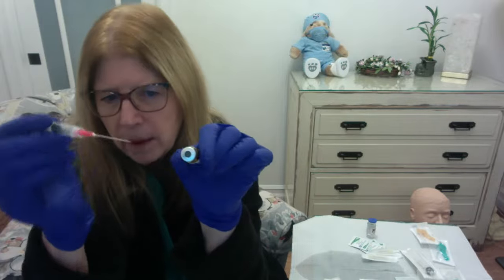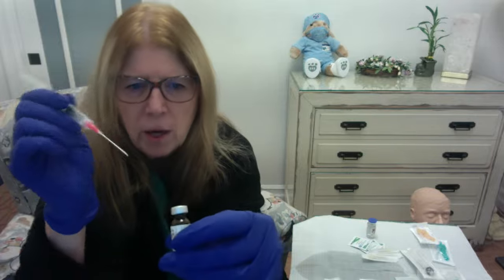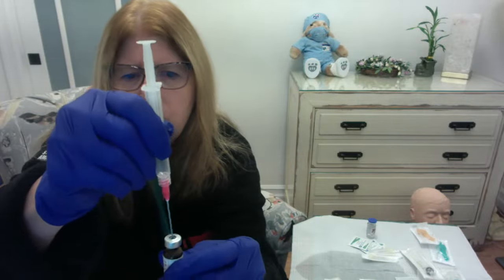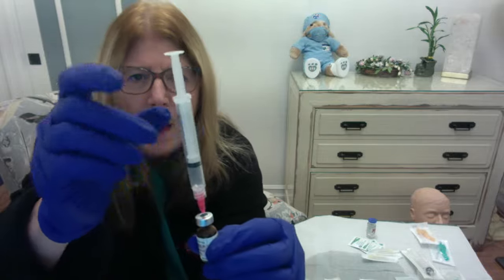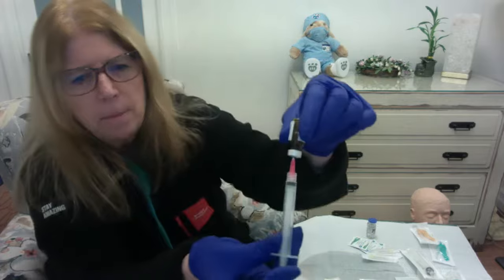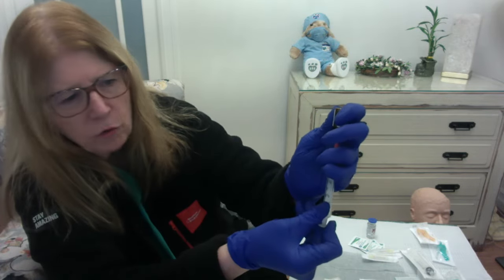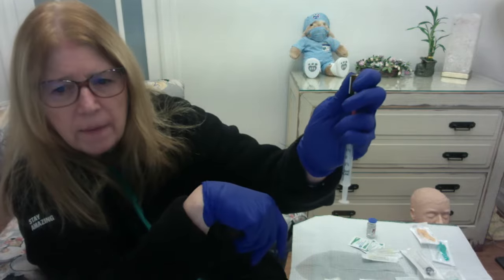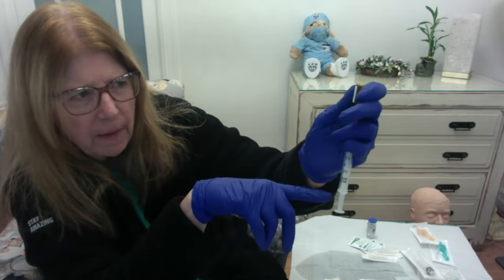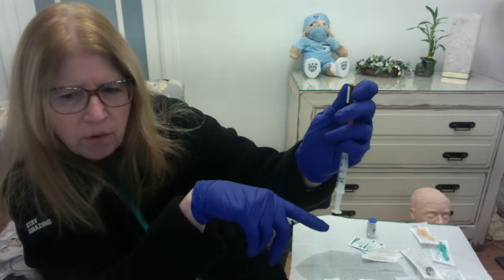So in that little rubber stopper with the little circle in it like a bullseye, I'm going to aim my needle right in there, and I'm going to give it a push in. And then I'm going to inject my air, and then I'm going to invert. I'm going to hold this vial and syringe with one hand. And if you could see, very slowly, this plunger is coming out very slowly.